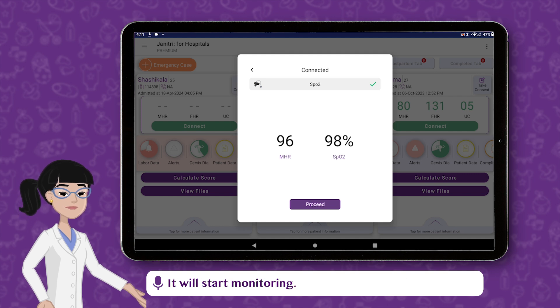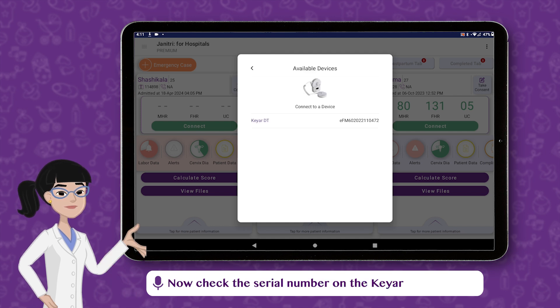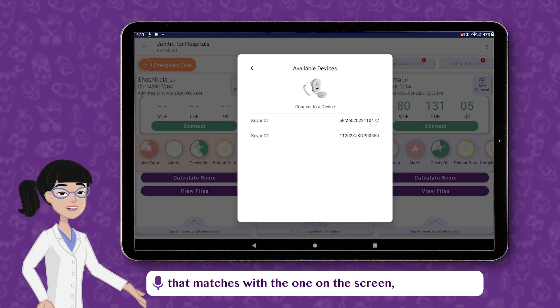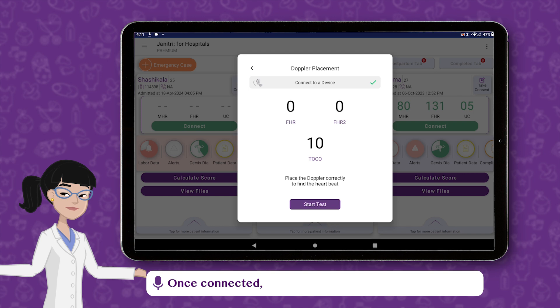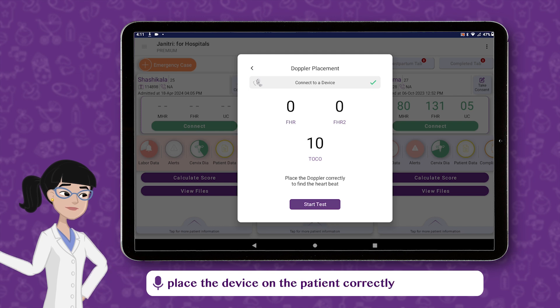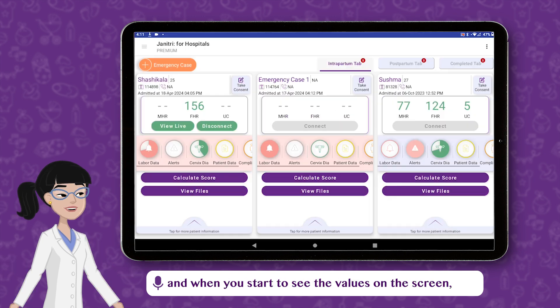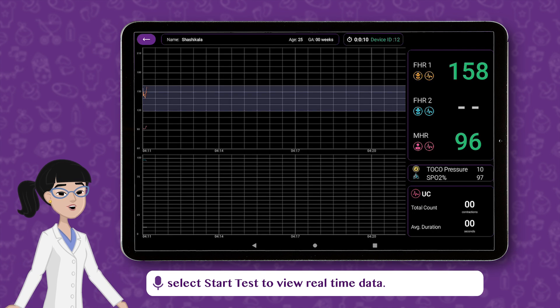It will start monitoring. Tap on Proceed. Now, check the serial number on the Keyar DT device that matches with the one on the screen and select the device. Once connected, place the device on the patient correctly and when you start to see the values on the screen, select Start Test to view real-time data.